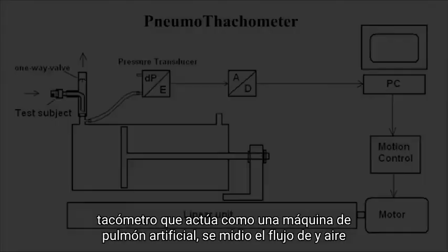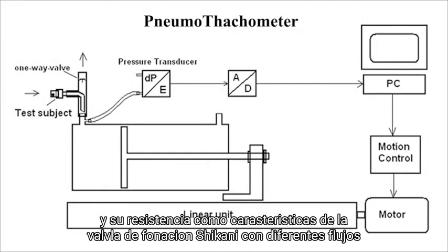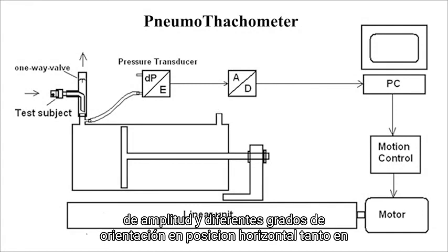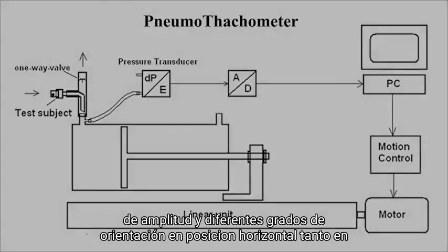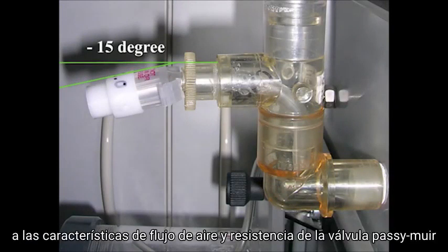Using a pneumotachometer, which acts as an artificial lung machine, the airflow and resistance characteristics of the Shikani speaking valve were measured at different flow amplitudes and different degree orientations from the horizontal, both in the 6 o'clock and 12 o'clock configurations, and these were compared to the airflow and resistance characteristics of the Passy-Muir valve.